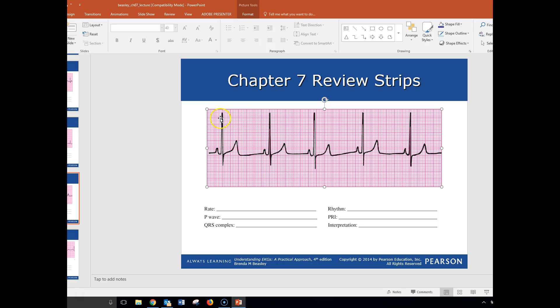I think I skipped something. Let's see. 300, 150, 100, 75, 60, 50. 1, 2, 3, 4, 5. So we're good to go.